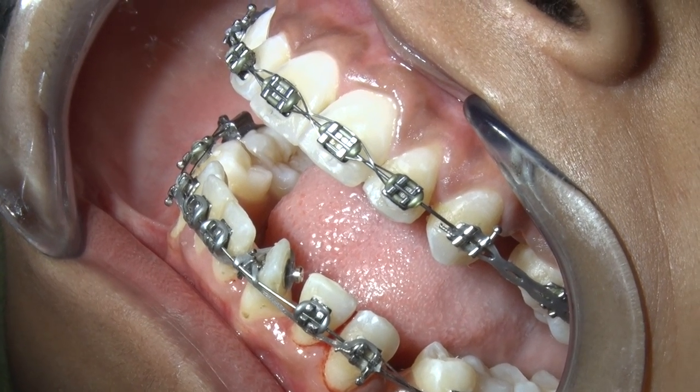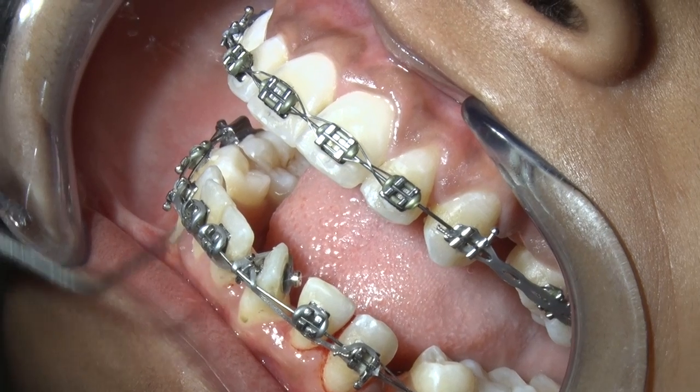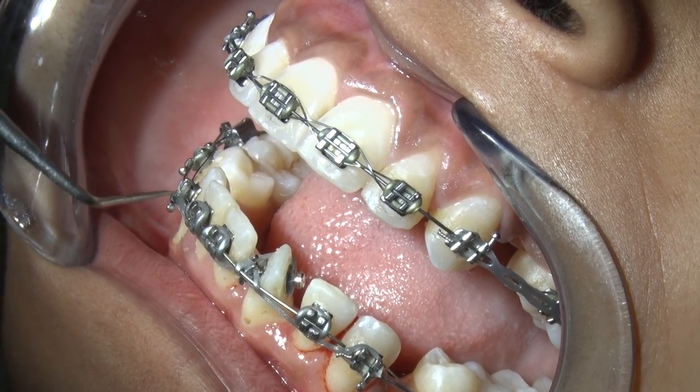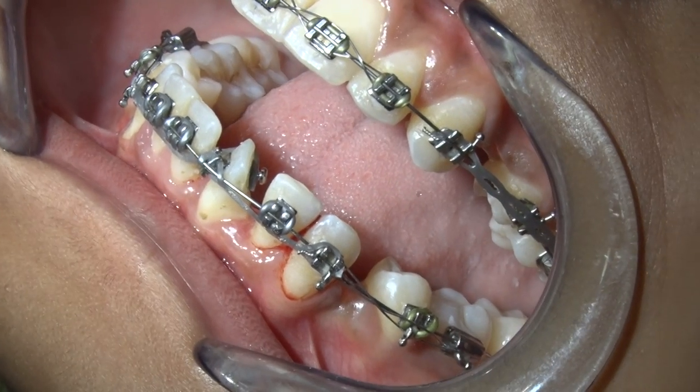The palatal button should be positioned approximately at the height of the arch wire, so that when we are placing it, the procedure becomes simple.